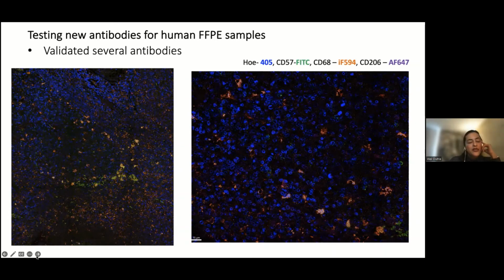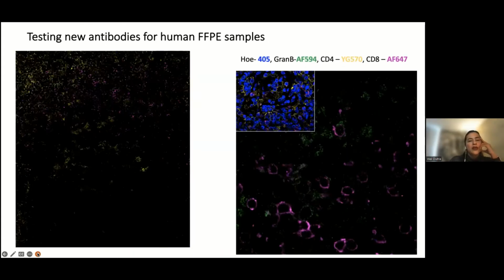So you have many different cell markers that you can use, and we standardized over 50 antibodies for different human markers. Here, one that I liked very much, because this is a cell population that I'm very interested in, which is the CD8 cells that you can see here stained beautifully in pink, and you can see the staining in green for a functional molecule that is granzyme.